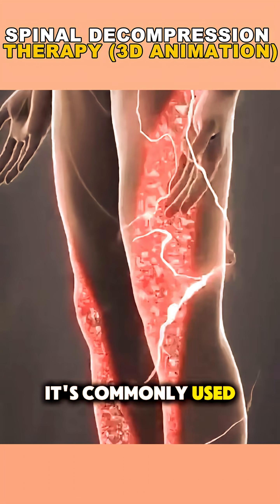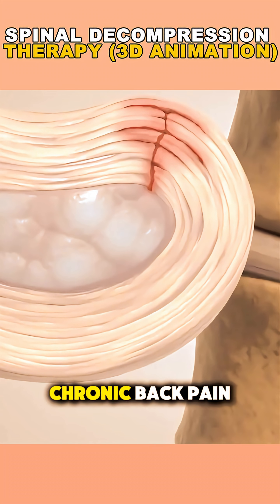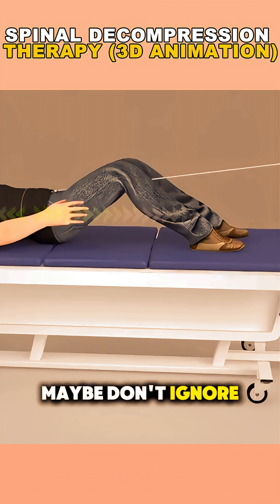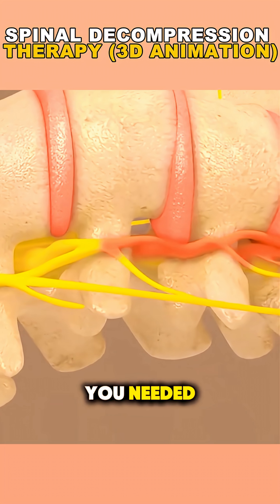It's commonly used for conditions like sciatica, herniated discs, or chronic back pain. And the best part? No surgery, no needles, just a gentle stretch that could make a big difference. So next time your back acts up, maybe don't ignore it — spinal decompression might be the solution you didn't know you needed.